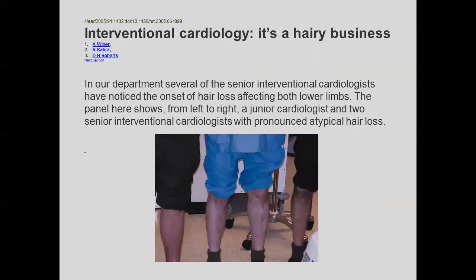But now, this is the last one. You asked about wearing lead protection on a leg. We had one guy from Australia come in here, and he had lead over his shin. It was the first time I'd seen it. This was about 8 years ago. And, you know, we had some requests to get it.